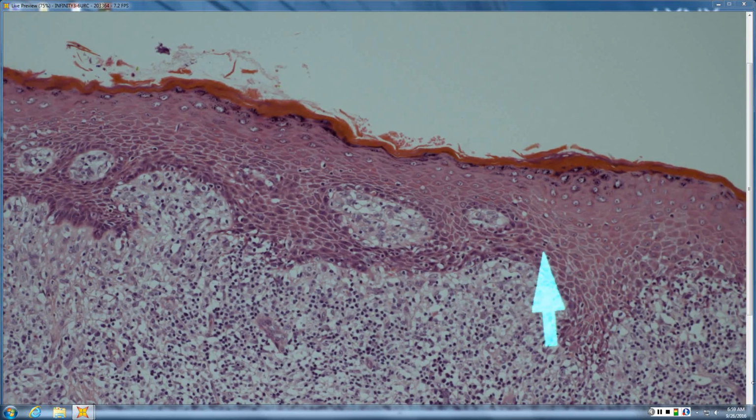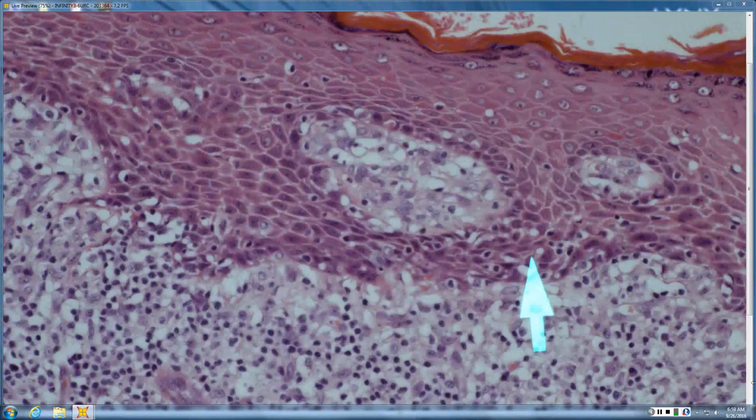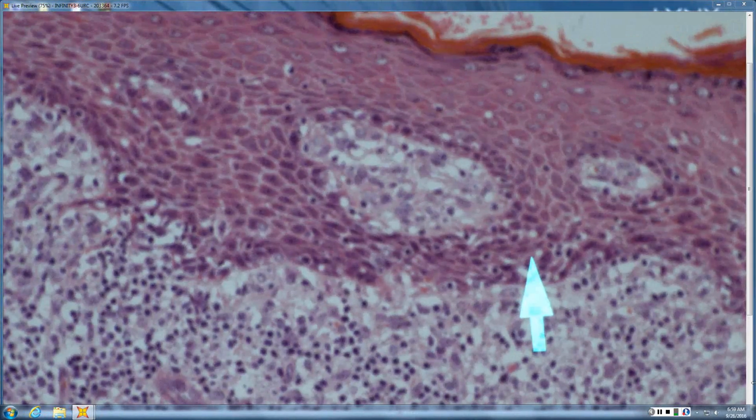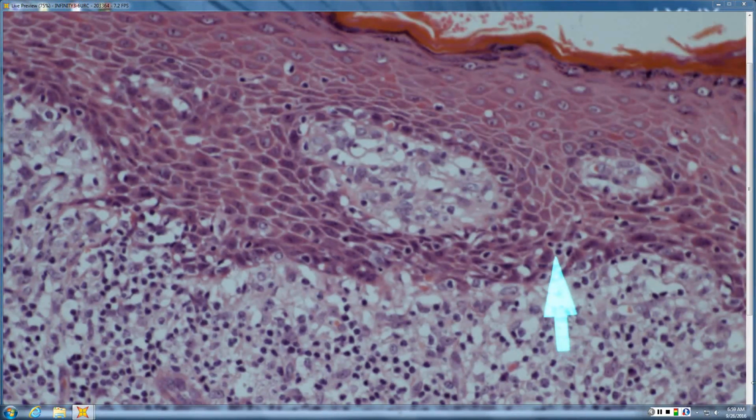They're hyperchromatic. Some of them are almost as large as, if not larger than, the keratinocytes, which is very atypical because typically lymphocytes are very small. So you have some, maybe a little more normal lymphocytes in here, but then some of these guys that are also probably lymphocytes are very large and either hyperchromatic or, in this case, more gray and vesicular and just atypical, weird looking. And this whole infiltrate looks odd. And so that goes certainly more with mycosis fungoides.